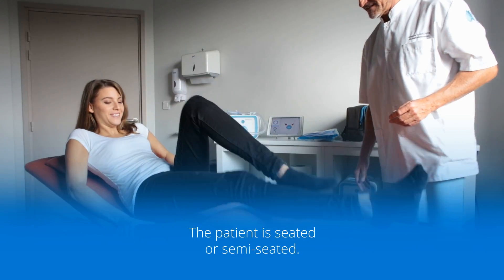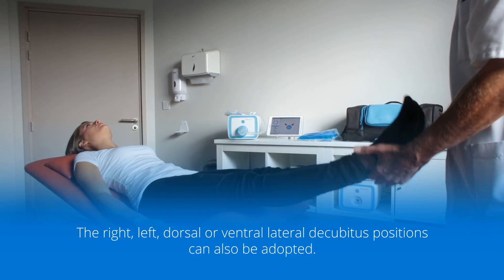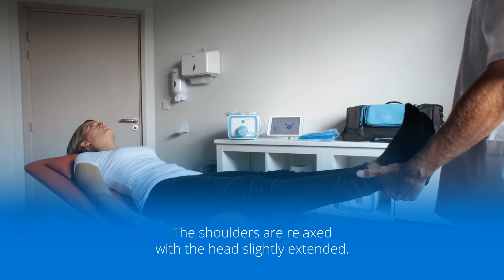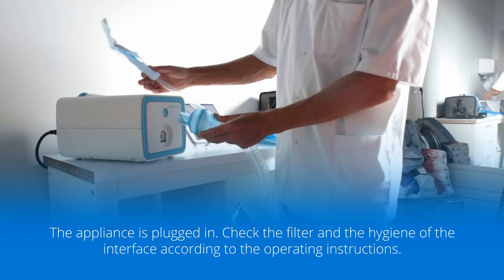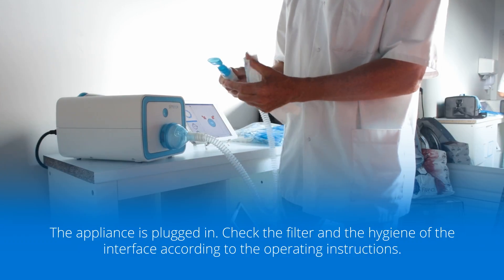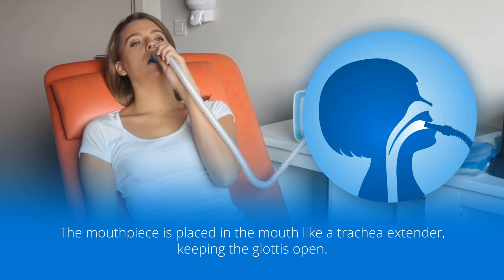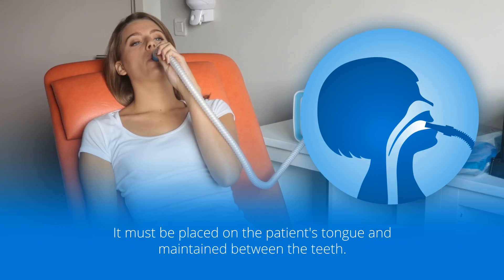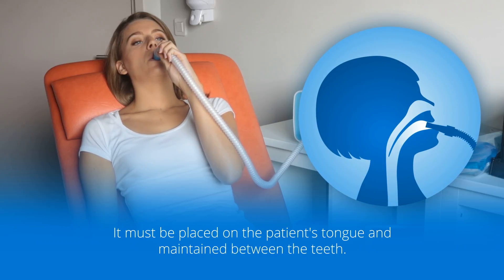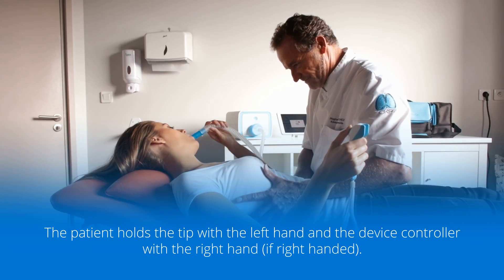The patient is seated or semi-seated. The right, left dorsal, or ventral lateral decubitus positions can also be adopted. The shoulders are relaxed with the head slightly extended. The appliance is plugged in. Check the filter and the hygiene of the interface according to the operating instructions. The mouthpiece is placed in the mouth like a trachea extender, keeping the glottis open. It must be placed on the patient's tongue and maintained between the teeth. The patient holds the tip with the left hand and the device controller with the right hand, if right-handed.